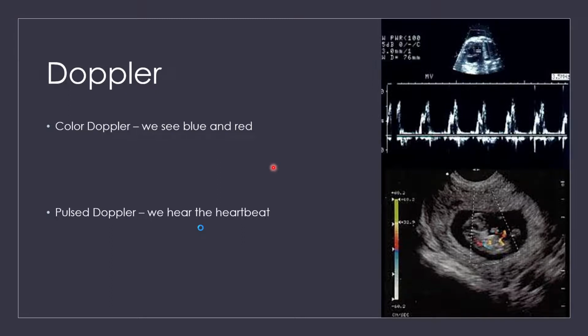Now after 14 weeks, it's not as frowned upon to use it, but only in diagnostic purposes do they use these things out in the field of sonography before 14 weeks. And because we are not diagnostic at pregnancy resource centers, we want to eliminate the use of color and eliminate the use of pulse Doppler unless it is necessary.